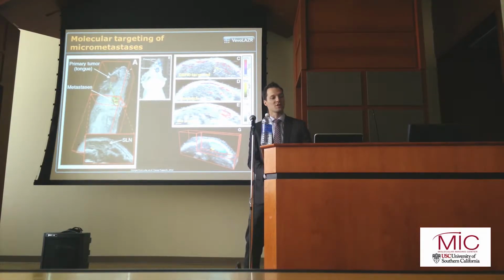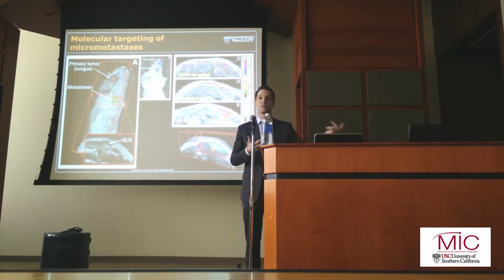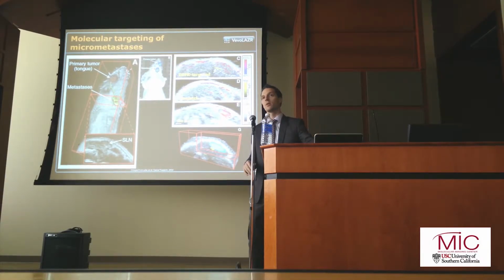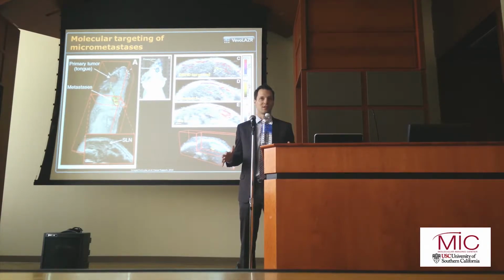They had a mismatch, so they had particles in there, but they weren't targeted to the cells. Okay, similar to that second dish in the previous slide. They didn't see any signal. No tumor, targeted particles, so that's sort of their negative control. They didn't see any signal.